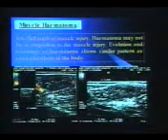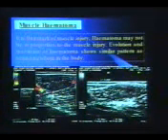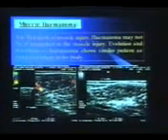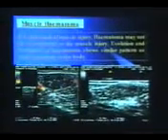Not only that, we can evaluate the healing process and also hematoma formation with ultrasound. This is a hematoma seen in the upper arm, pressing over the muscle, the axillary vein, and also over the brachial vein. The patient was referred for a venous study of the arm swelling.